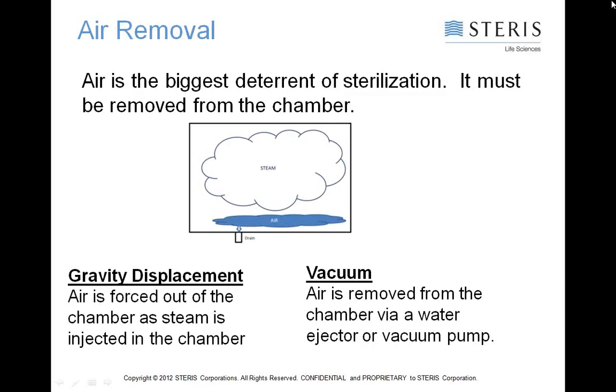Something that's maybe not so much in our control, but we do want to at least give mention to, is the steam saturation, the amount of moisture in the steam. Steam contains the greatest amount of moisture when there's no liquid condensate present. We want to have as much steam packed in there in the form of steam, not water, as we can. And of course, it's a difficult problem for any of us to address, and usually would require the help of your facilities personnel, or possibly a manufacturer or a service organization. They can come in and test the quality of your steam.